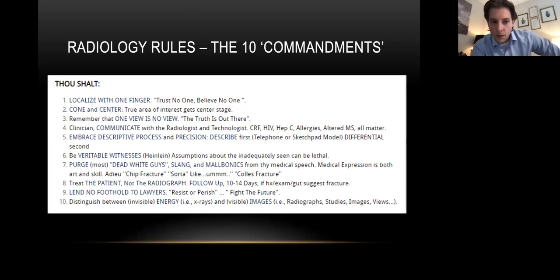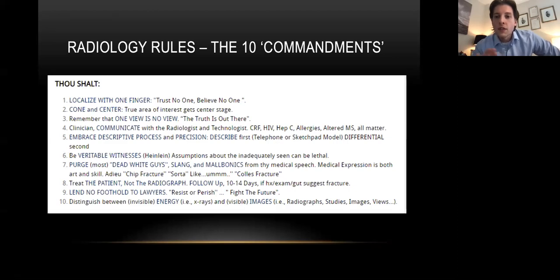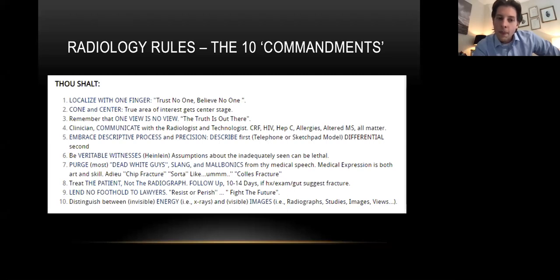Number three is the most important rule: always look at the orthogonal view. If you have a frontal ankle view, you want a lateral view as well — a view that's 90 degrees to your first view. There are many examples of fractures only visible from one angle; some are hidden around the back or side of a bone. So one view is no view — you always need at least two views. Sometimes we do more than two, such as with the scaphoid, where we do four views because fractures there can be very hard to see.